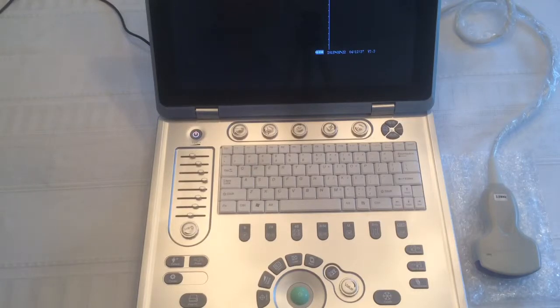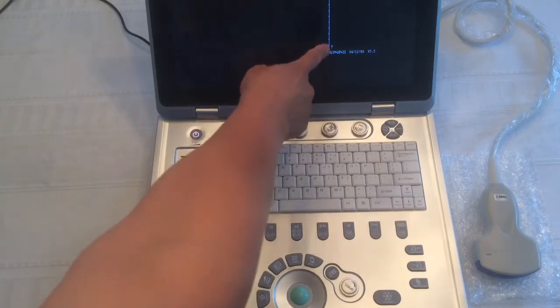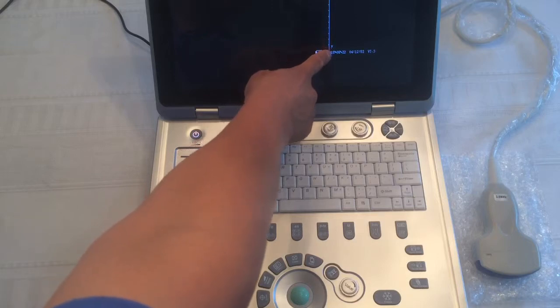Okay, so to do any measurement, the most important thing is to make sure after your scan, you press this button, freeze, to make sure the image is frozen. Okay, so you should see an F. That means the image is frozen.